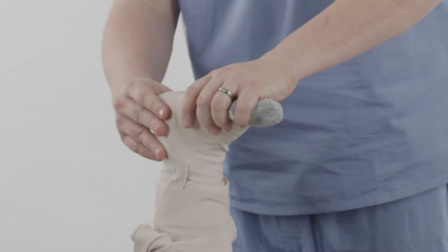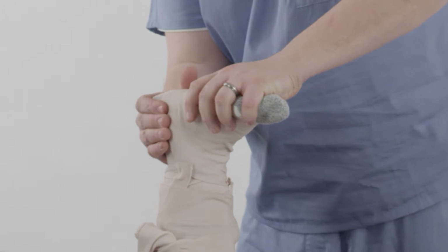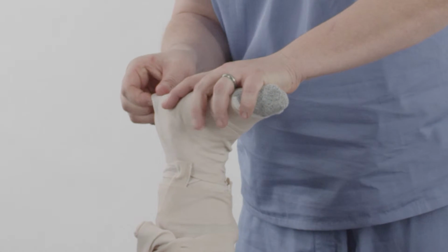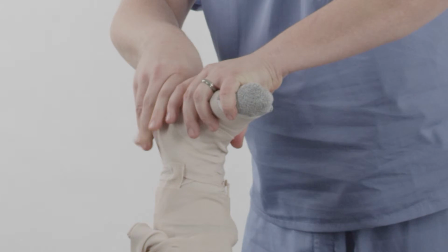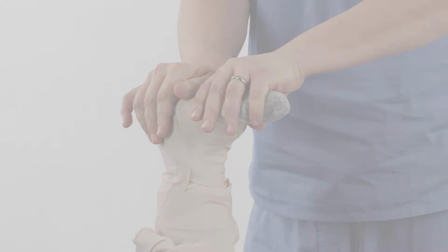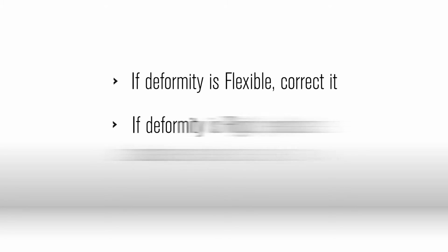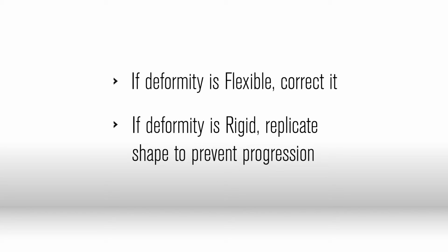If the patient has a flexible deformity, increase the medial longitudinal arch with your palm while squeezing the hind foot with your fingers. Increase the varus or valgus forces as desired or appropriate for your patient, or simply replicate the shape of the foot to prevent the progression of the deformity.